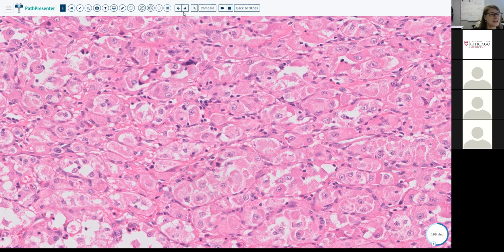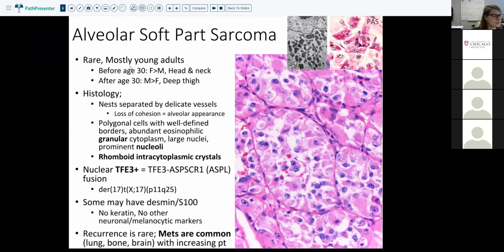So I'm going to discuss what you guys voted for. The winner of the wrong cases was malignant extrarenal rhabdoid tumor, and I think that's also a very good thought, because a lot of these tumors have this morphology of abundant cytoplasm, right, with big nuclei, with prominent nucleoli. And that includes alveolar soft part, that includes rhabdoid tumor, that includes, what did you say, PEComa, right? But I think the thing that is particular about this is really that nested growth pattern.